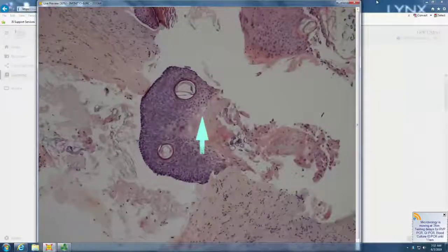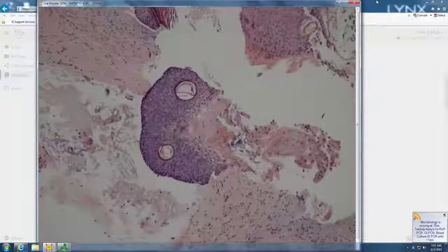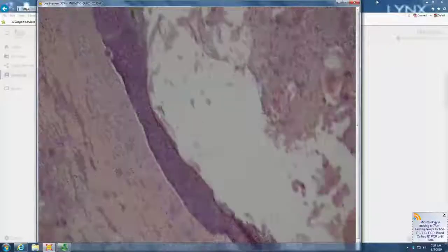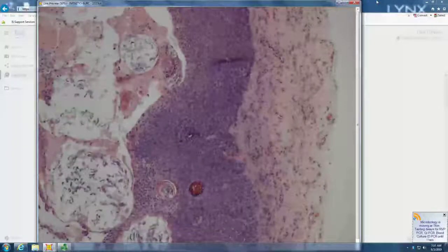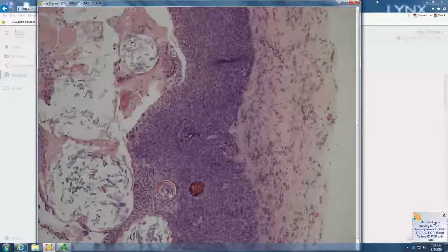It can have shadow cells like pilomatrical change. It even has some reddish trichohyalin granules. So it's differentiating towards all parts of the hair follicle. So what would you call a cystic panfolliculoma? Panfollicular. Yeah, cystic panfollicular. Without a hair shaft, also can be linear. So sometimes you can have actual hair shaft formation too. Yeah.